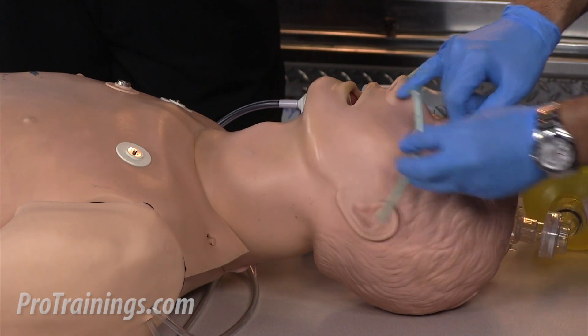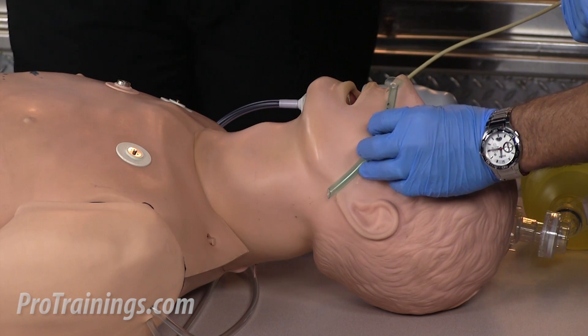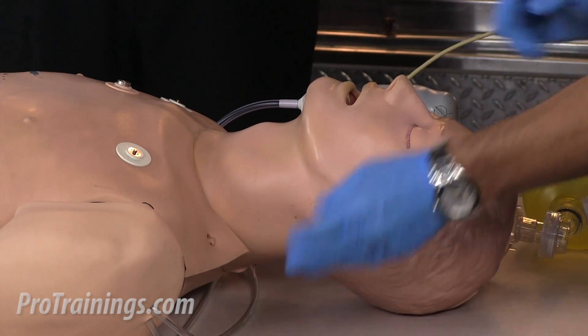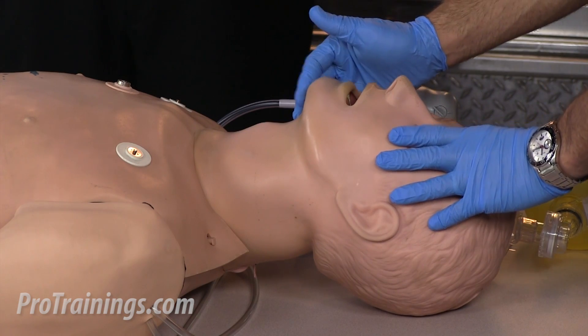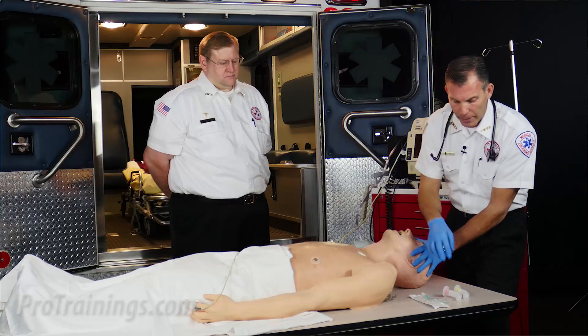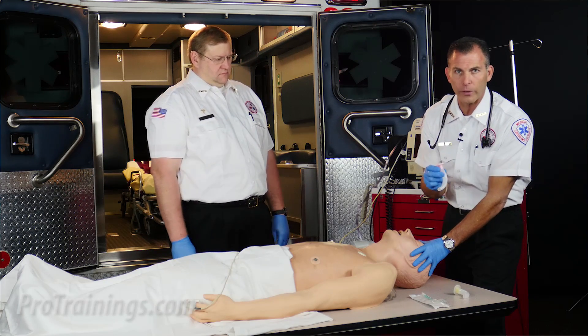The way to measure the nasal pharyngeal airway is from the edge of the nostril or the nare to the ear lobe. In this case you can see this nasal pharyngeal tube would be about the right size. But because I believe this patient is unresponsive and probably doesn't have a gag reflex, I'm going to do a head tilt chin lift and prepare to use what we call an OPA, or oral pharyngeal airway.